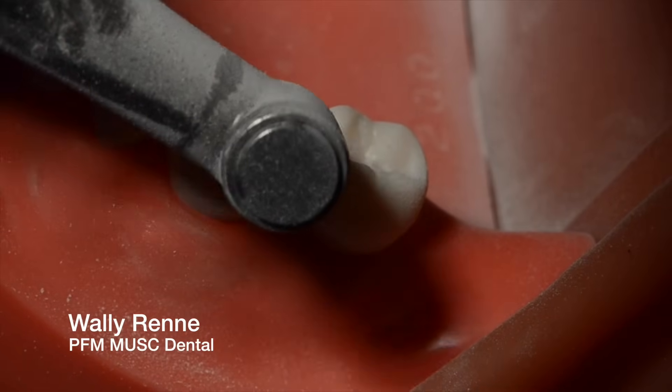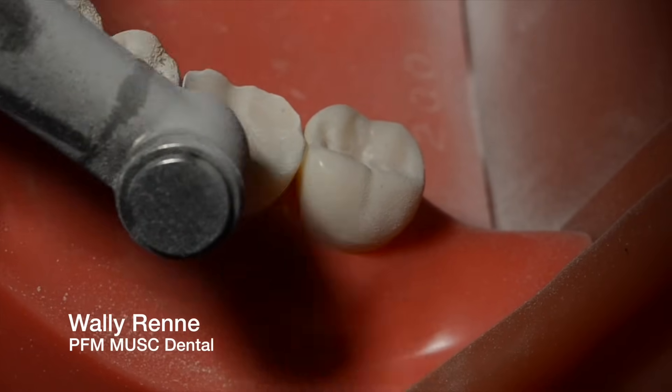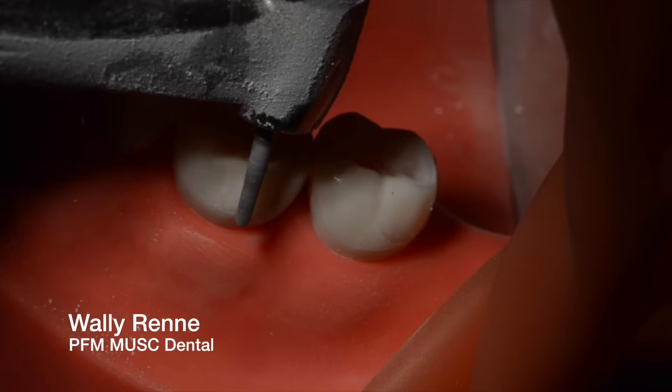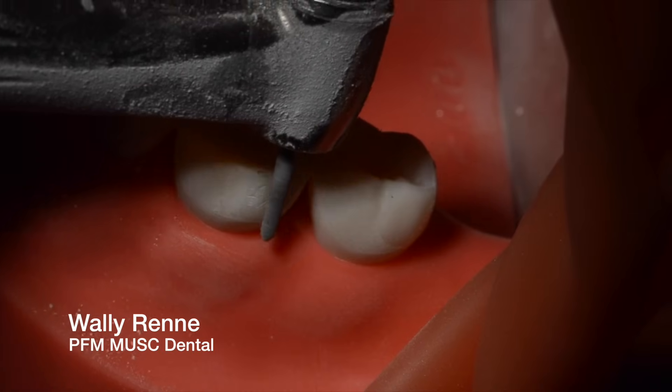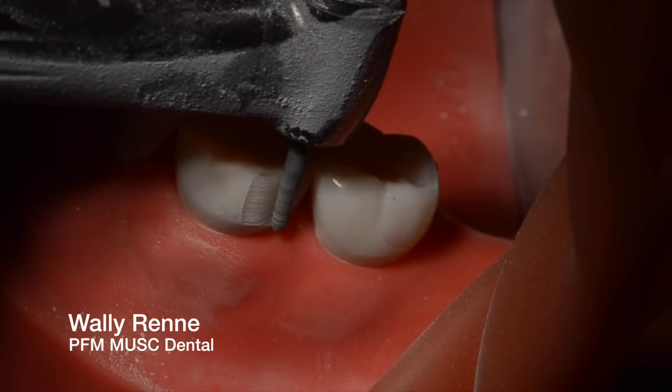Alright, I'm not really worrying too much about anatomy. I'm going to do a simple Y shape with the football, and I'm going to re-accentuate that later. Switch to a 878K018 chamfer diamond for heavy chamfer, and I'm not doing depth cuts on the axial walls. I think that's ridiculous.